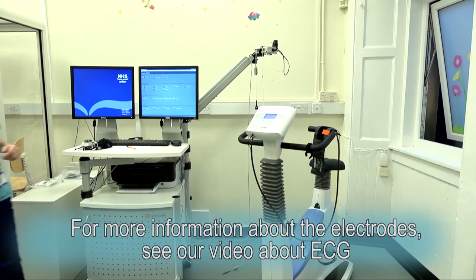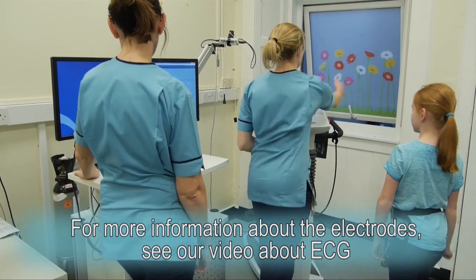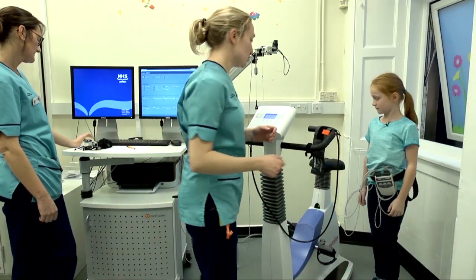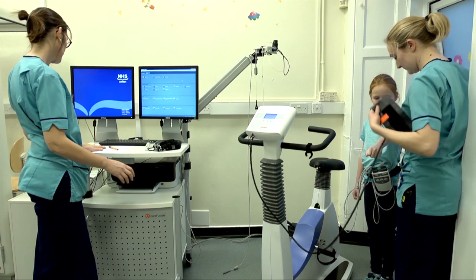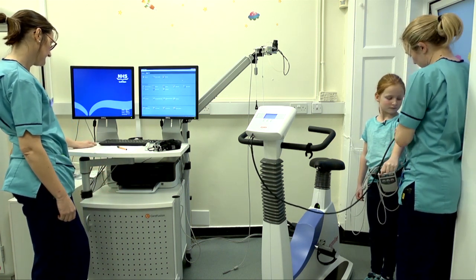So we've got your stickies on your chest now. We've got you wired up and we'll get everything else attached too. If you want to come round and stand at this side of the bike for me. So that just fastens round it, and what it'll do is it'll just tighten up every few minutes. That's going to tell us what your blood pressure is — it tells us about the blood inside.